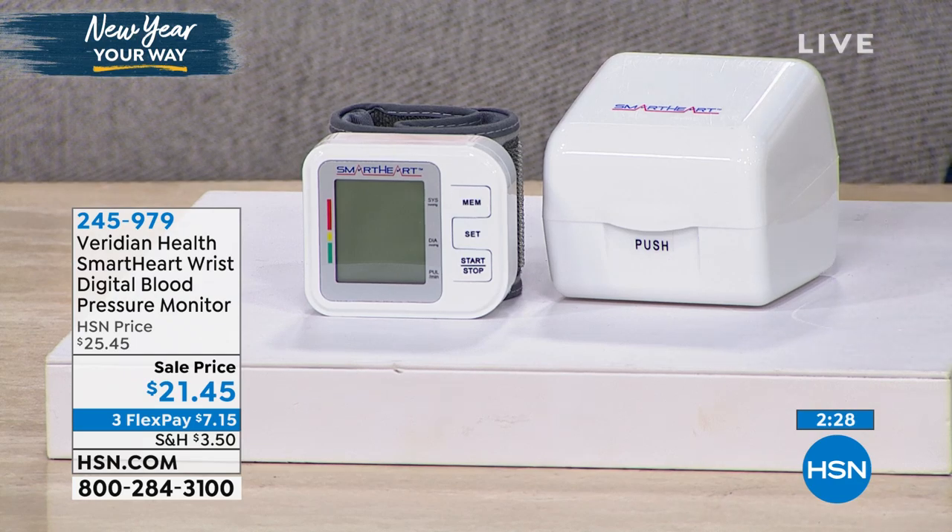Gentlemen, ladies — even children these days are being diagnosed with high blood pressure. It's crazy what's going on out there. The statistics are alarming. It's really an epidemic.